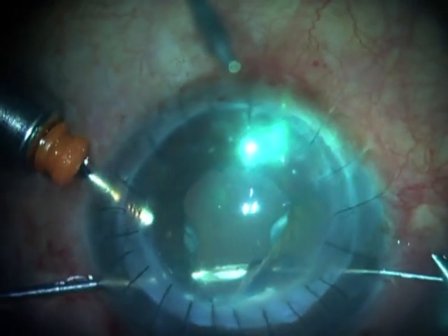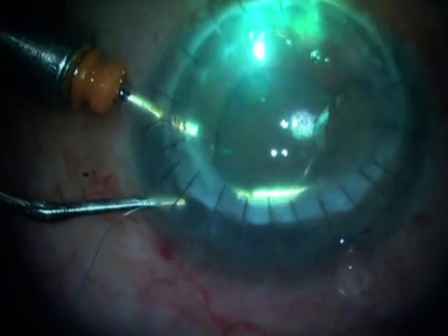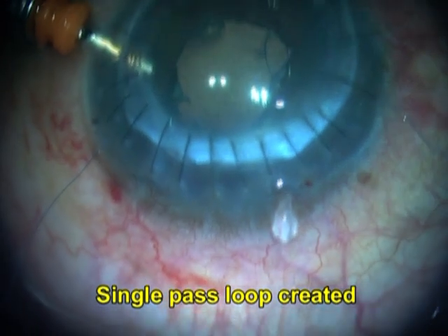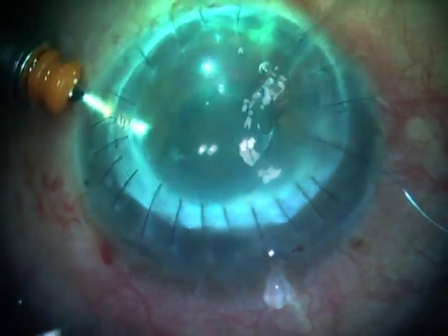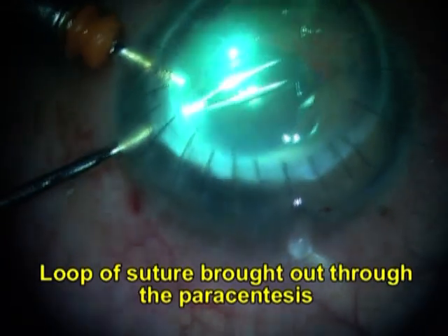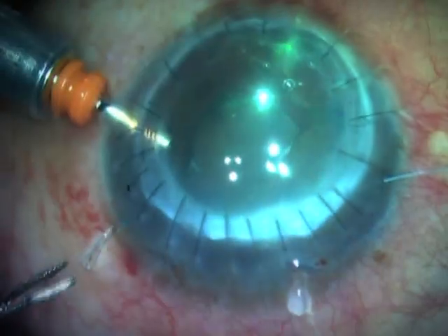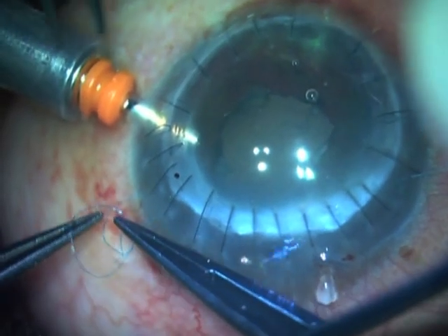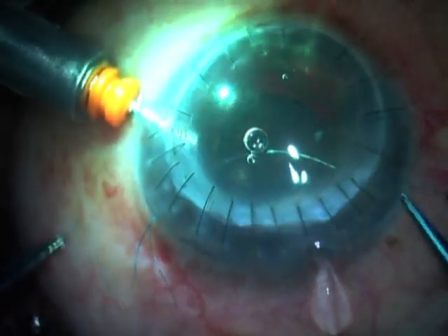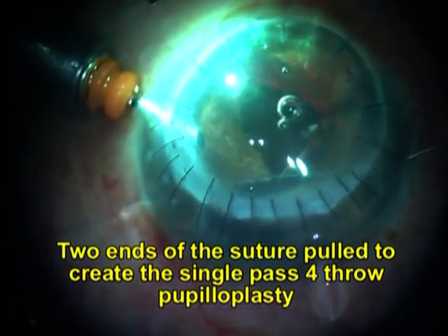A 9-0 or 10-0 straight needle Prolene suture is passed through the clear cornea and through the iris. From the opposite end, a 26 or 30 gauge needle is passed through a paracentesis and then through the iris. A single pass is created and the loop brought out through the paracentesis. Subsequently, 4 throws are done, sealing the pupilloplasty. A 4-point or 6-point traction can be done depending on the nomogram.